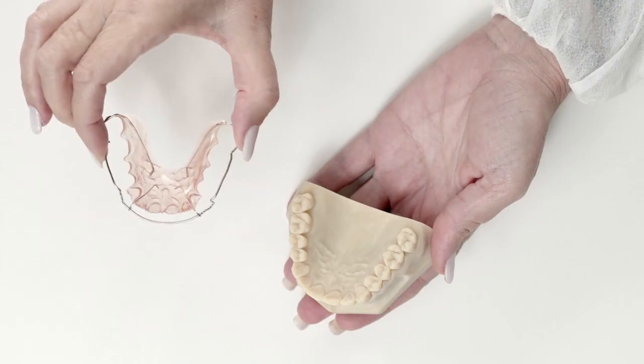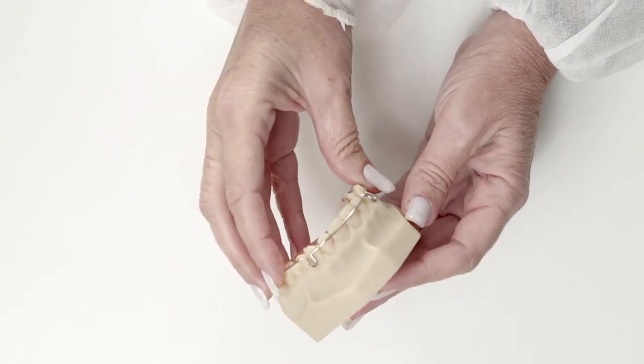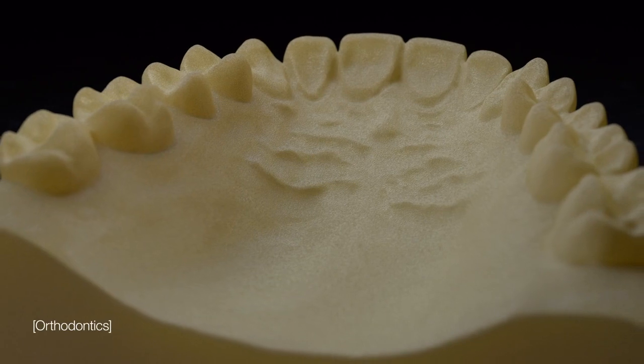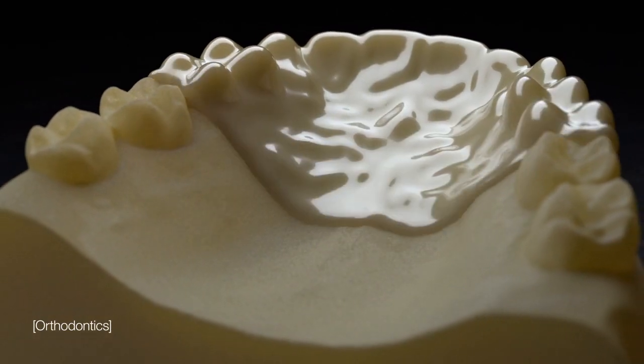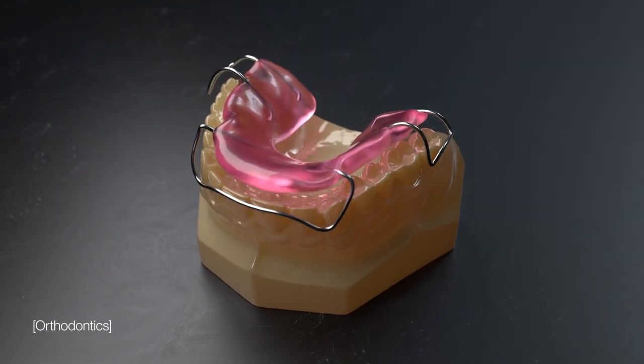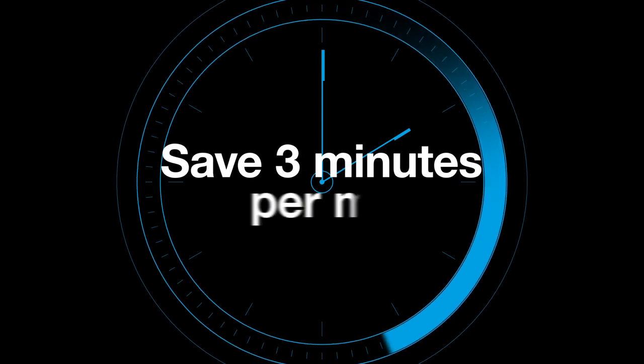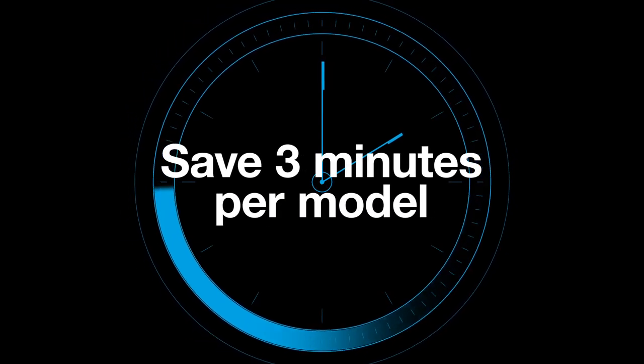Cut days off delivery times by producing more accurate, comfortable orthodontic devices. Our unique separator digital material coats models in print, minimizing post-processing time and making acrylic and wax removal easy, helping to save up to three minutes per model in manual labor.